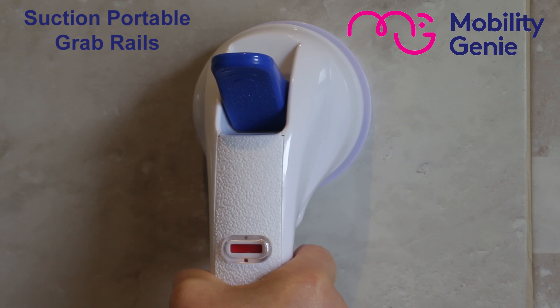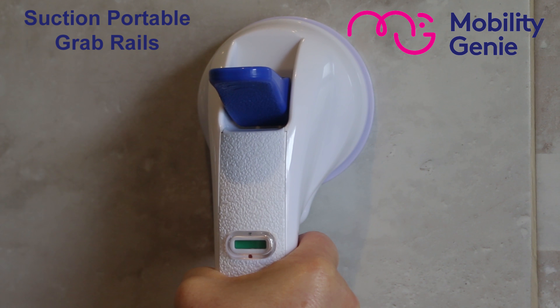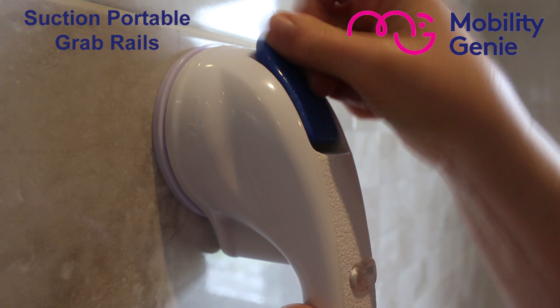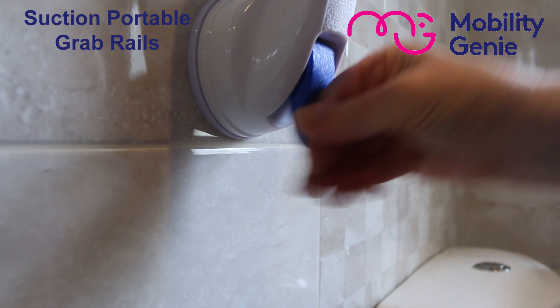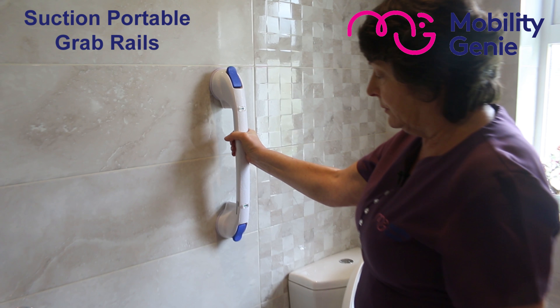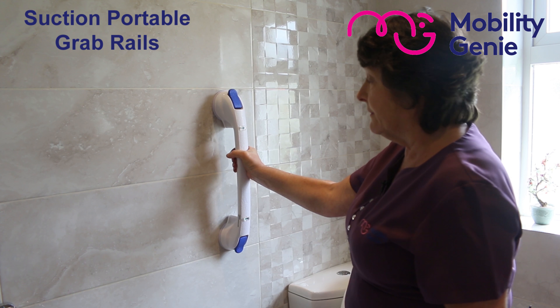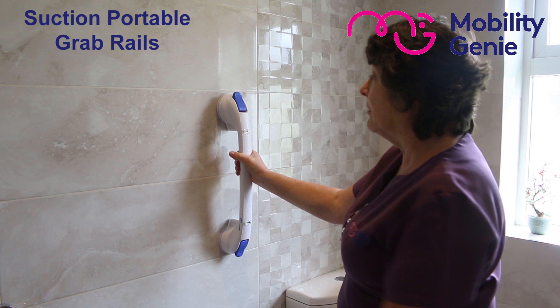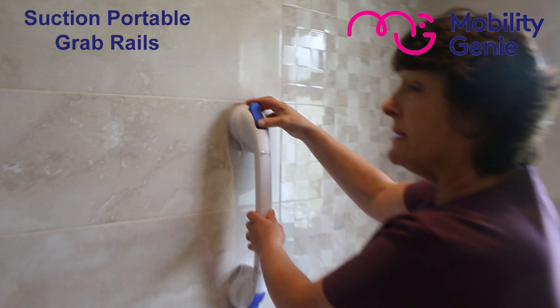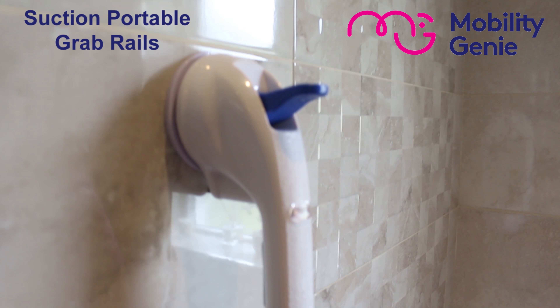Some tiles might be a little bit ridgy, so I'd be careful and test it well. I wouldn't put it where the grout is on the tiles because I don't think you'd get enough adhesion. The two pads that you attach onto the tiles sit against the glass surface, and then you press down your locks.